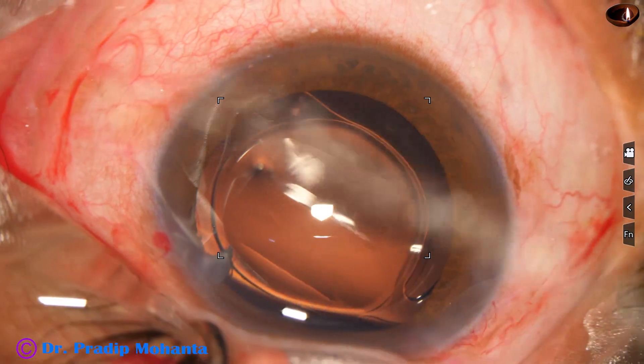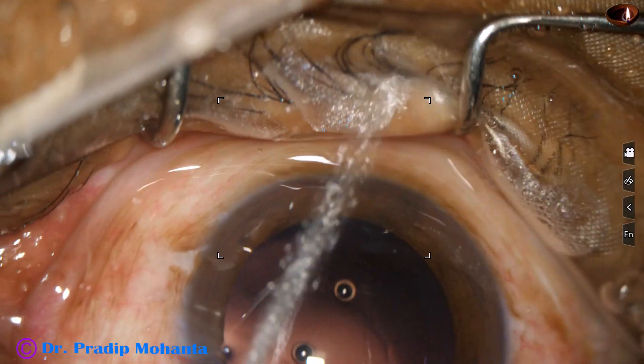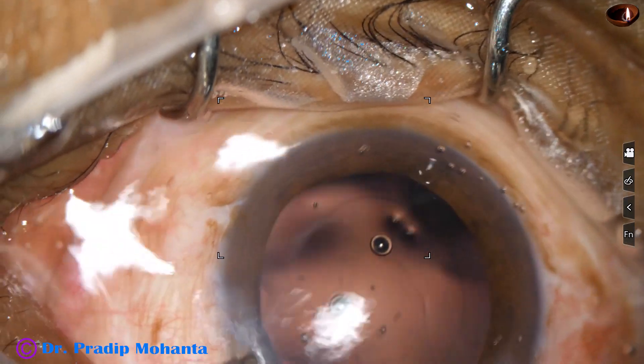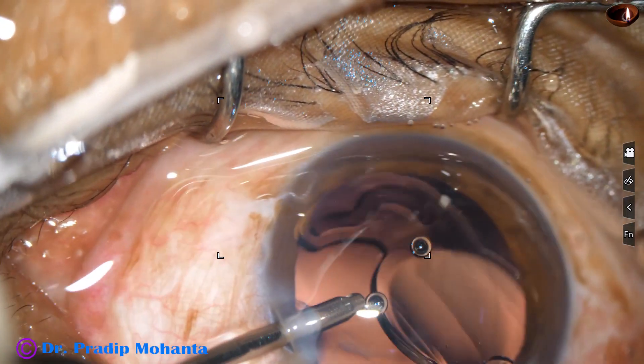And now see — let us see another one. This is also a hydrophilic acrylic lens, but it opens very abruptly.